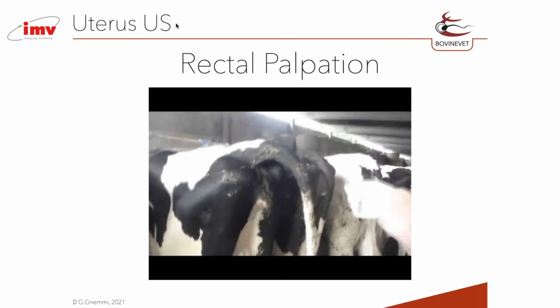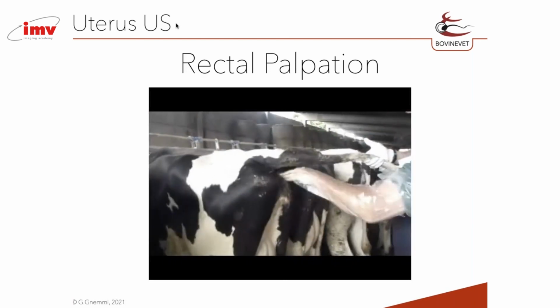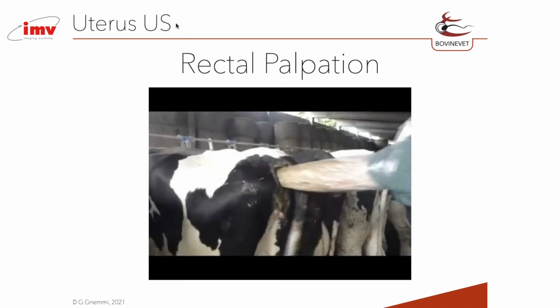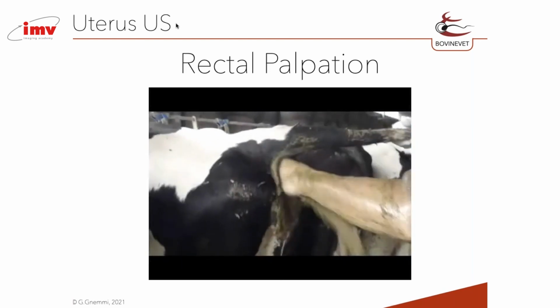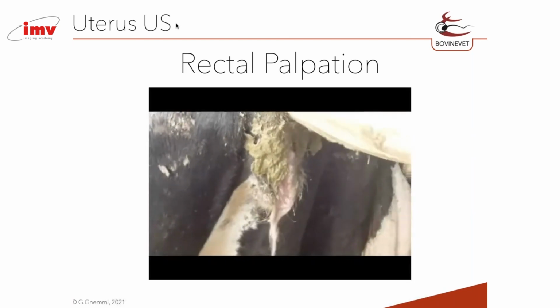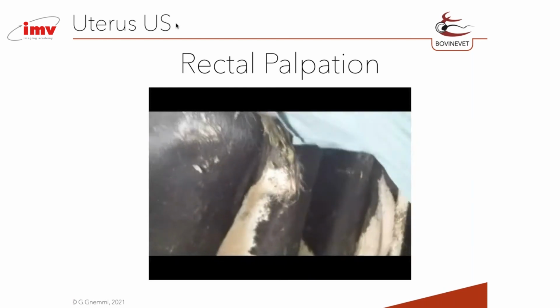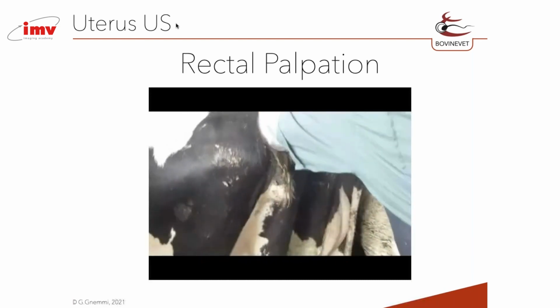Some people like to use the rectal palpation, but we have to remember that with rectal palpation, in 40–45% of cases it is not possible to produce vaginal discharge. And attention, some people are checking the tonicity of the uterus, saying that if there is a metritis, there is no contraction of the myometrium. It isn't true. Also in perimetritis, we have sometimes a contraction of the myometrium.